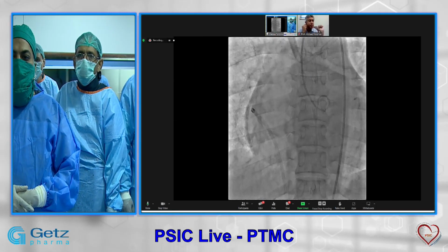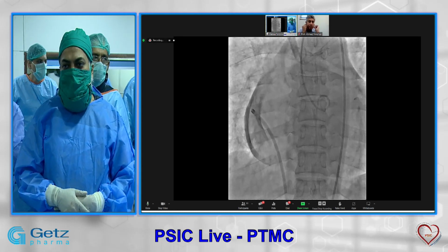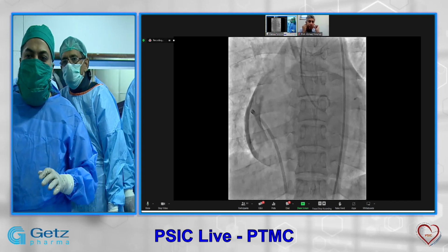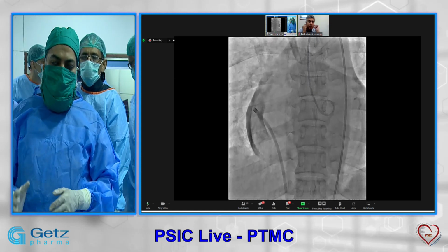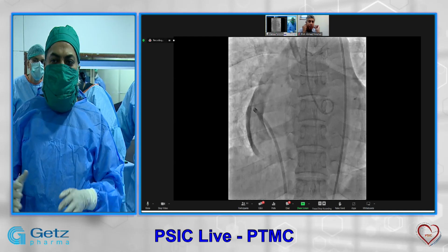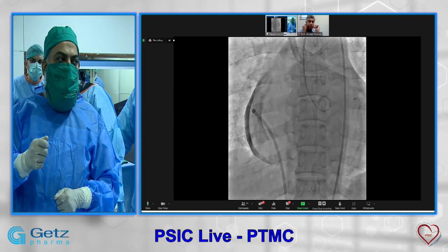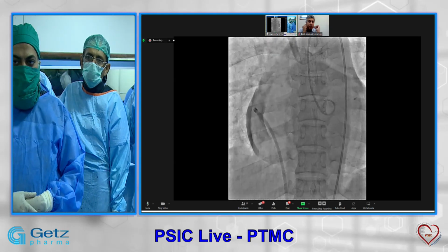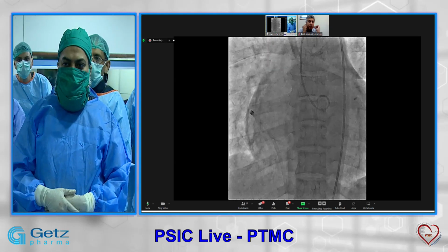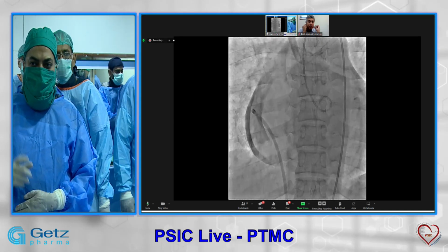And you confirmed that your dilator is now in the pericardium. Again, in this one, don't panic. Just stitch the sheath there. Some people suggest device closure, but I think in our circumstances, you can simply leave it there and shift the patient for surgery. That's what we did in this patient. But there are options of closing this with a device.